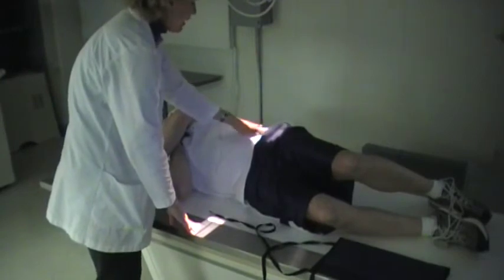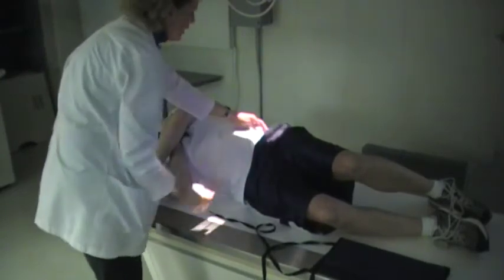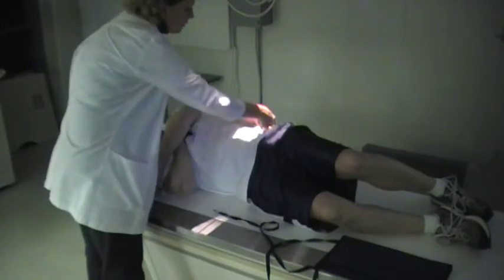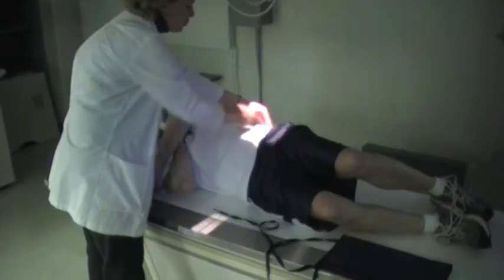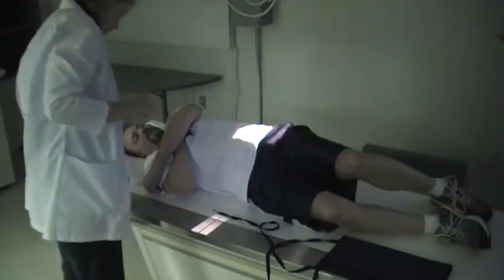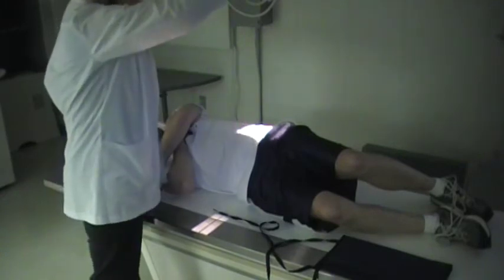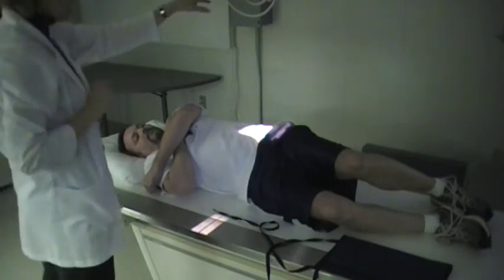You want to palpate for the ASIS and then come in front of it approximately one inch. You can see the line cutting across the ASIS, and then you can see the sagittal line one inch in front. Since I'm imaging the left SI joint, you can place your marker right here and we can collimate just a little bit on the sides. That is our left SI joint.